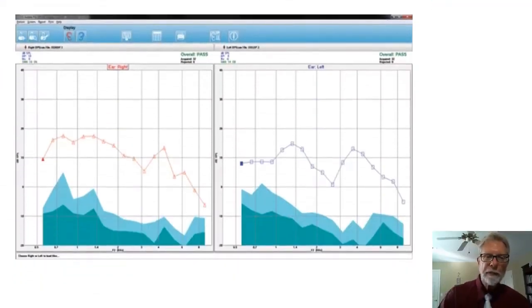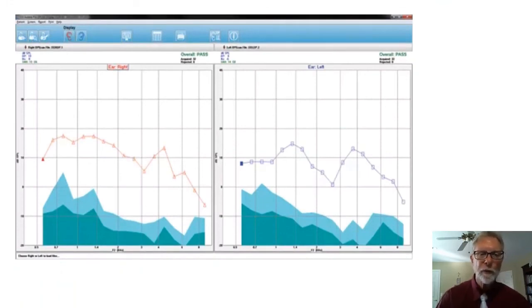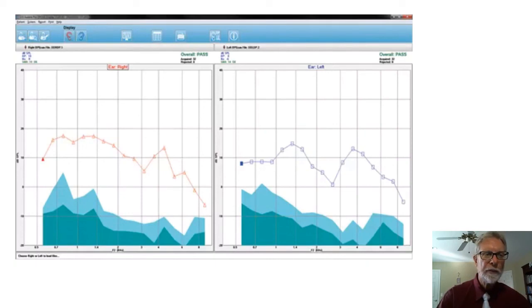Here's a comprehensive diagnostic DP-OAE, 12 or more frequencies. And as you can see, the levels are displayed as well as the noise level.